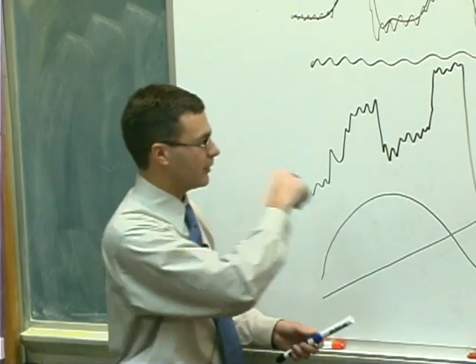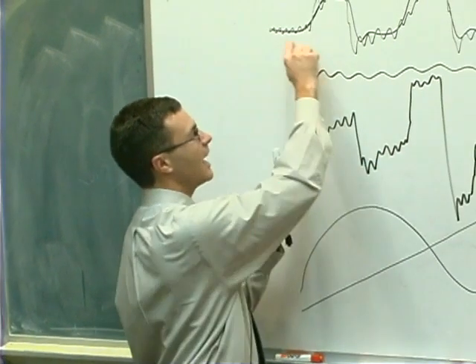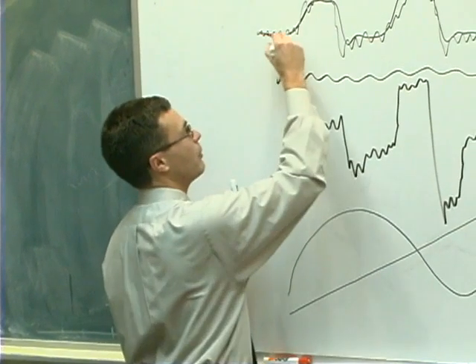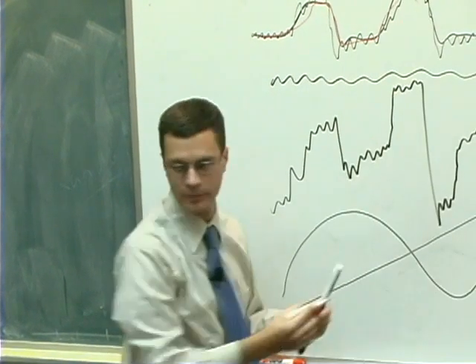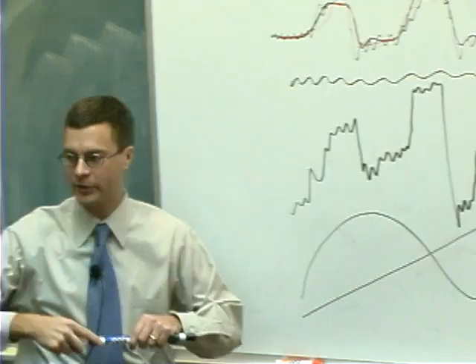Okay? I could take this data and say, oh, I'll take a little bit of this, and let's remove these little high spiky things, and eventually, I can take it down to where it's a perfect representation of what I'm looking for. And so obviously, that's not a property that you want to have in an honest statistical analysis of data.